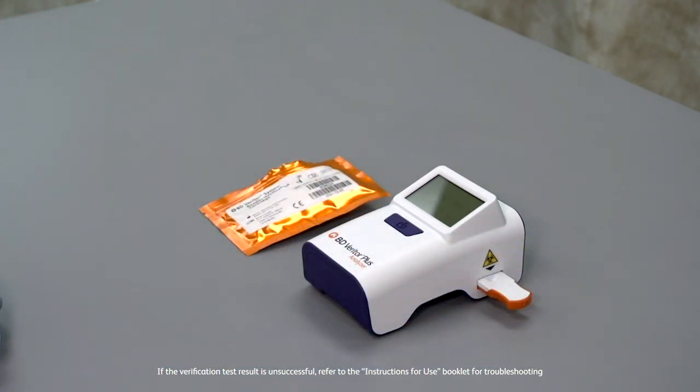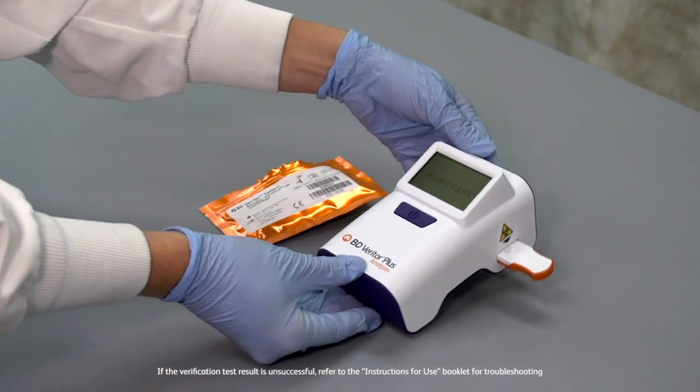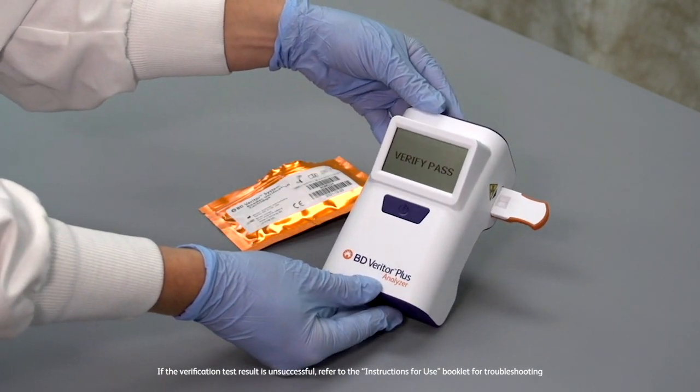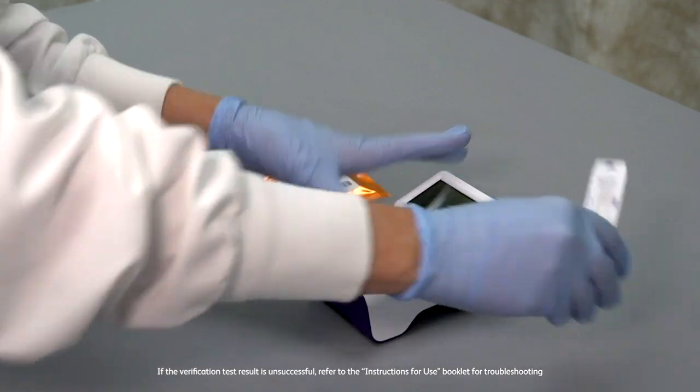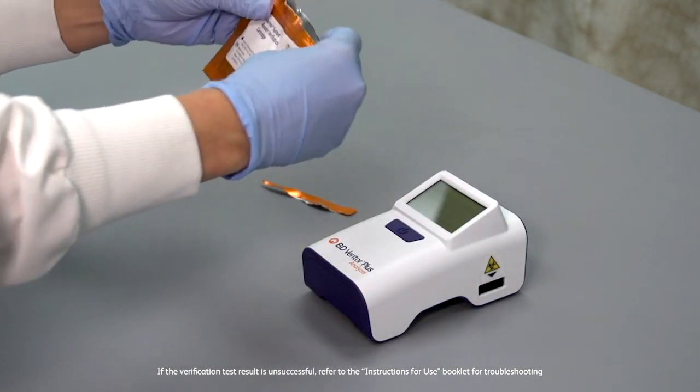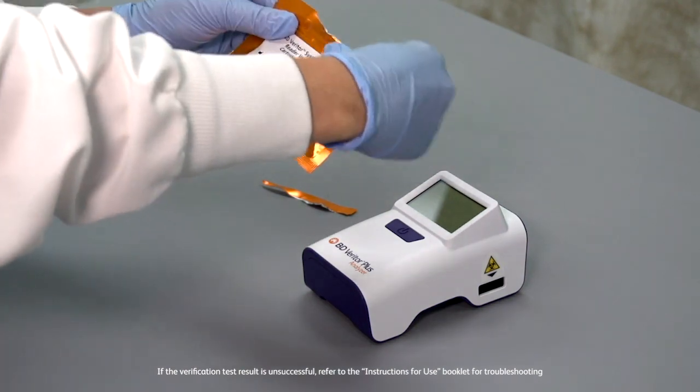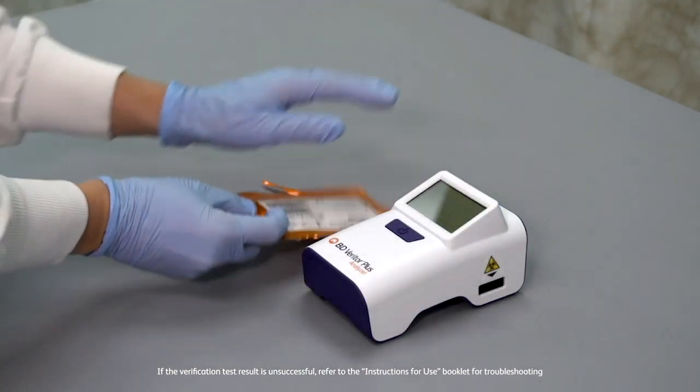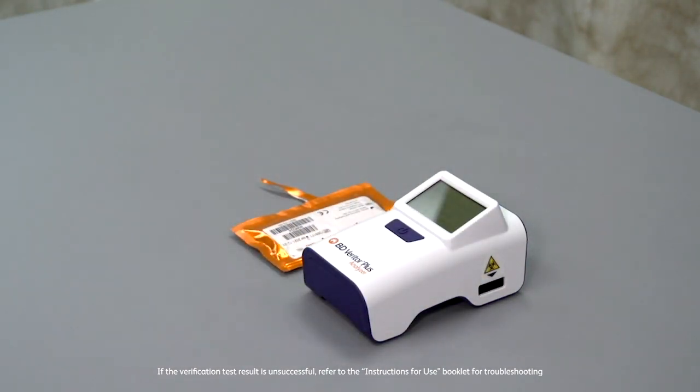After a quick three-second reading and analysis, Verify Pass appears on the LCD screen. Store the verification cartridge in the original Ziploc pouch for regular use. The frequency of verification testing is determined by each site's regulations or practices.